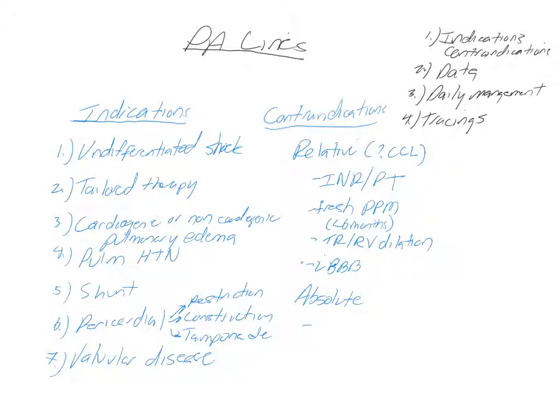Those are fairly limited to a mechanical prosthesis, so you cannot float a PA line through a mechanical tricuspid valve, or the presence of an RVAD, a right ventricular assist device.